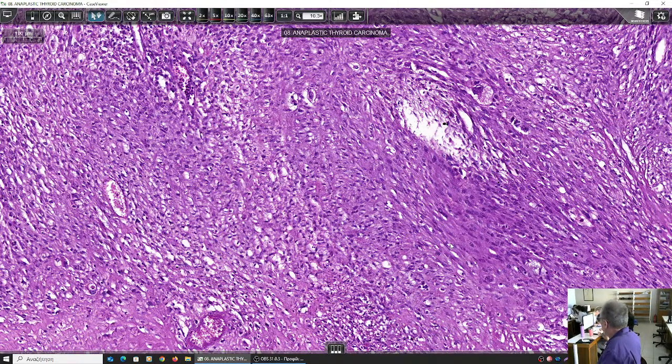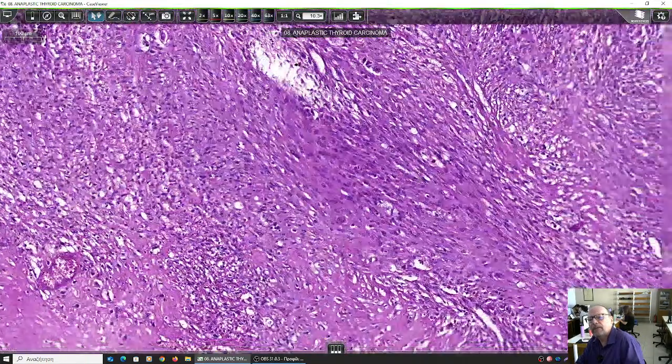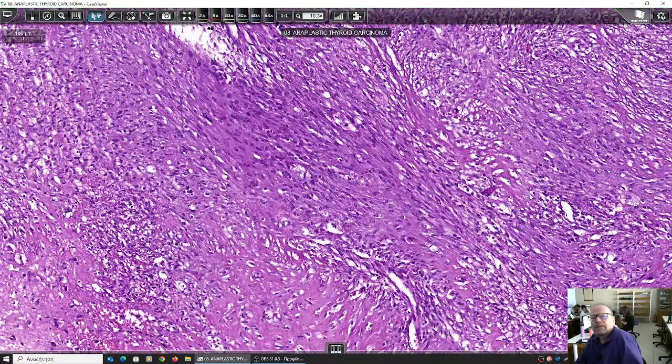If you see malignant spindle cells, what would you think? The carcinoma is not the first malignant tumor that you think of. If you see a spindle cell population, which tumor would you think it is if you see just this area? Because I see some sort of fascicles and spindle cells. What does it appear like here?